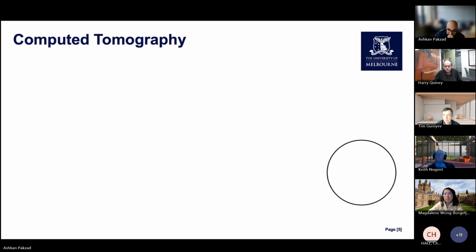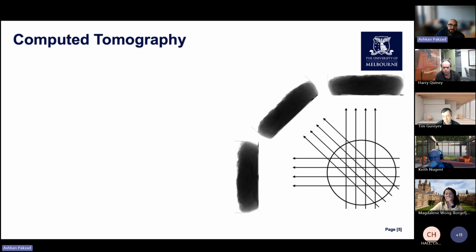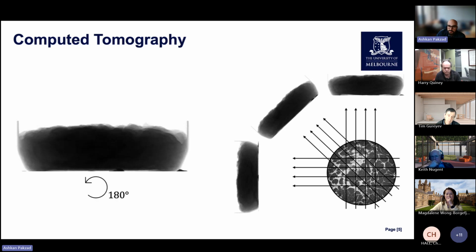So in X-ray CT, we are looking at a true 3D volume, unlike, for example, tomosynthesis, which I showed earlier. We have an isotropic spatial resolution, and we're imaging the breast without compression. So this is in CT achieved by taking these 2D X-ray projections at multiple angles through 180 degrees or 360 rotation, and we reconstruct the slices into a 3D volume.